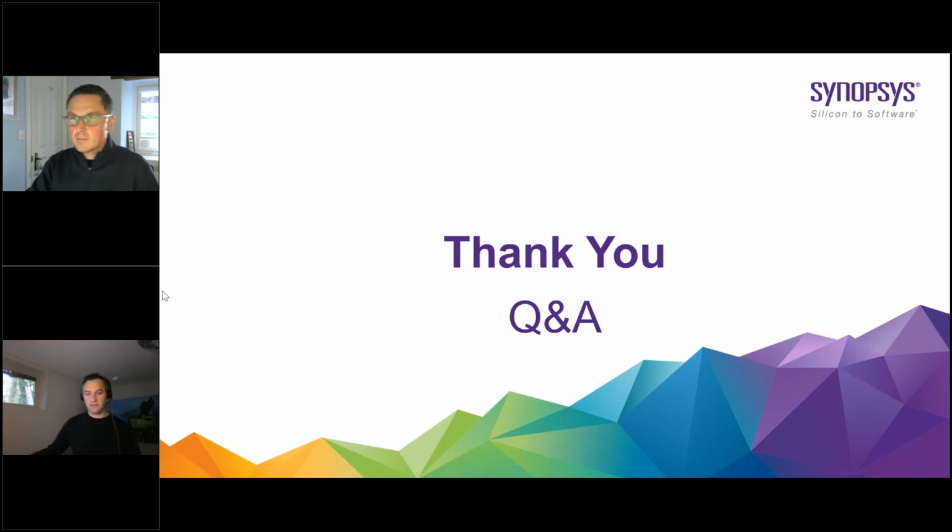Ross, have we got any questions? Yeah, it looks like we've got a couple coming in. Let's have a look. Yes, the first question we have here just says error rate, question mark. I think that came in during the AS Ortho slide you were presenting, Karim, or maybe the custom model ones.